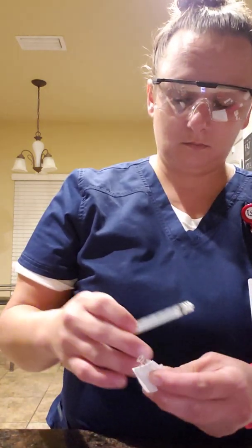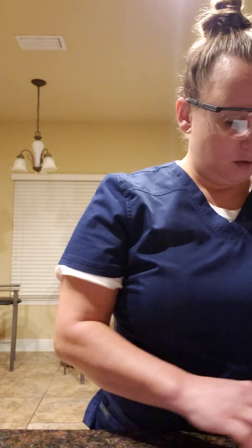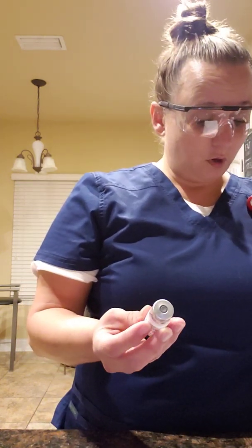I'll use an alcohol swab to clean the vial. Now I will connect the cannula. The order is for 5 milligrams IM every 4 hours as needed for pain. Available is 10 milligrams of morphine sulfate per 1 milliliter. Therefore, I will need half a milliliter.